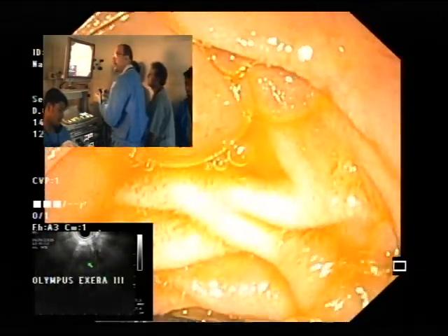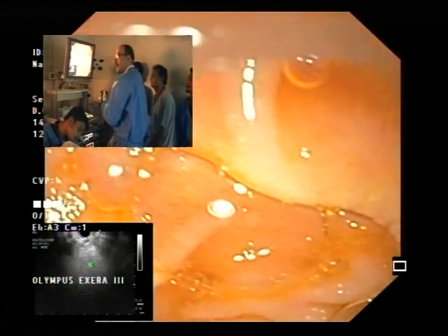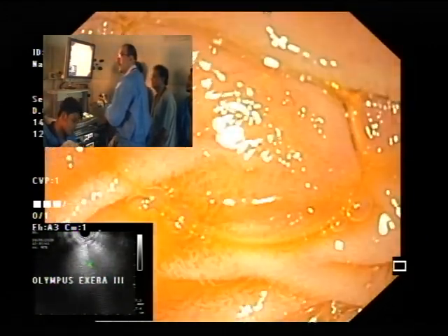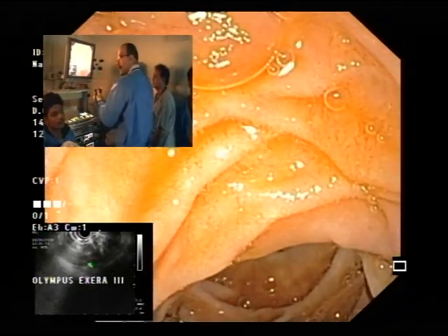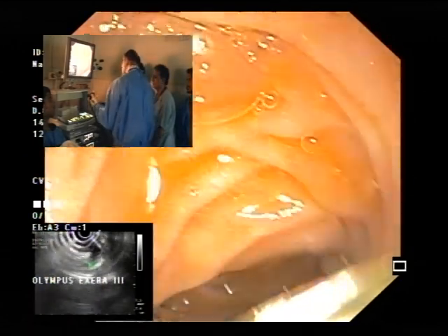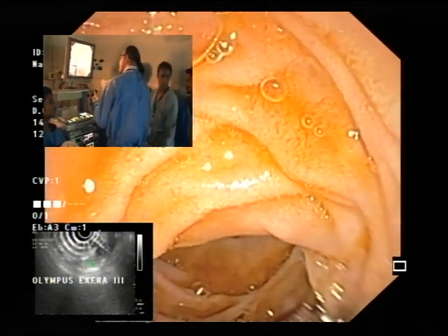with this scope, this is the best we may be able to see, but you can grab a biopsy forceps and just lift the fold to see if there is a fish mouth papilla. Otherwise, you know that it's going to be behind this fold based on the other folds. At this point, I typically will put my balloon up a bit and turn my body clockwise. Just like in ERCP, turning this way will stabilize your scope.